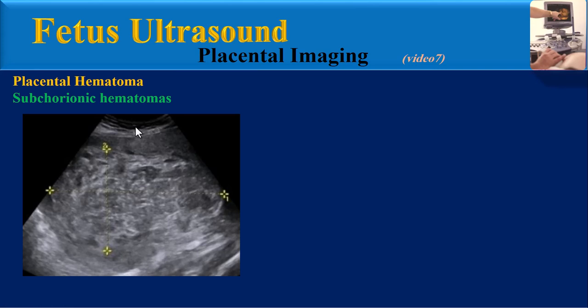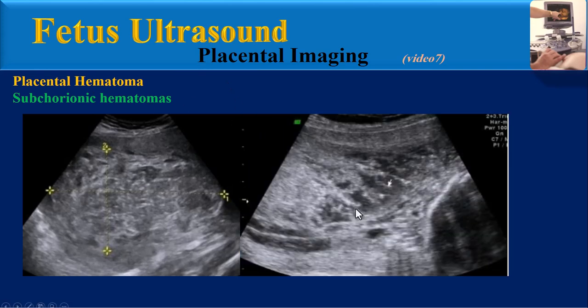Ultrasound screening scan showed FGR with a large placental mass of about 14 cm. This image shows a heterogeneous aspect of the placenta, and the calipers indicate the limits of the massive subchorionic hematoma. The placenta is heterogeneous on the chorionic side and more echogenic on the basal side.